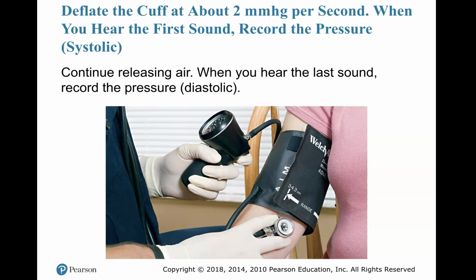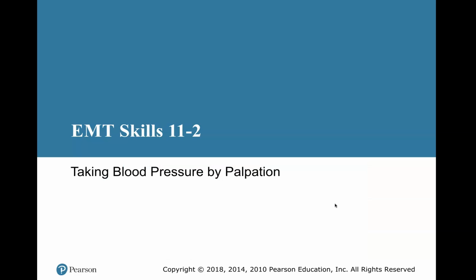And when you hear the first sound, that is your top number, your systolic number, and the last sound you hear is going to be your diastolic number. And we will practice this way more in class. This is not a good practice for taking proper blood pressure.